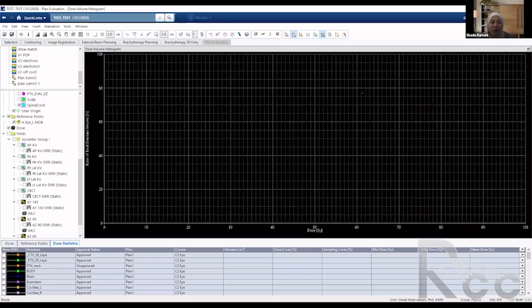And what you said right now, I'm going to show. It took me some time to create these two plans because I wanted to show kind of a DVH. And using the DVH, people might say, oh, I want to choose this plan. But then when we go to the isodose plan itself, they change their mind. Or I think people will change their mind.